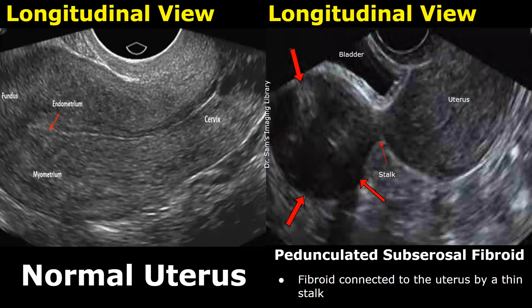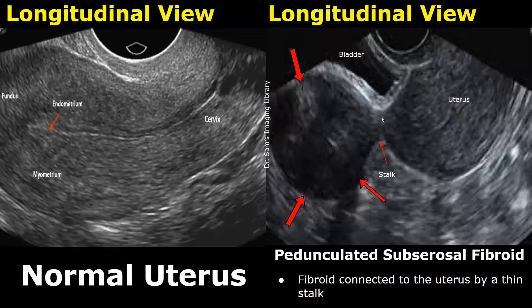Here is another case of pedunculated subserosal fibroid. We can see a fibroid growing outwards and it is connected to the uterus by a thin stalk.